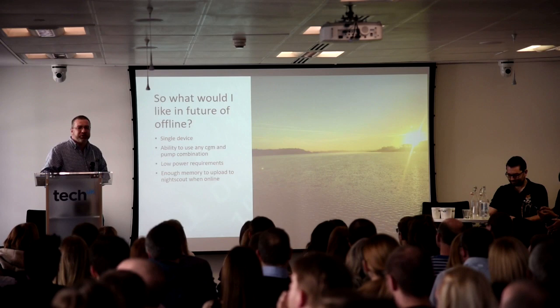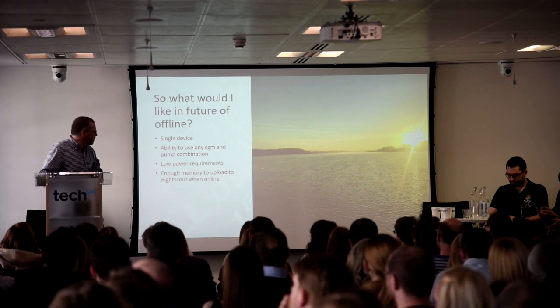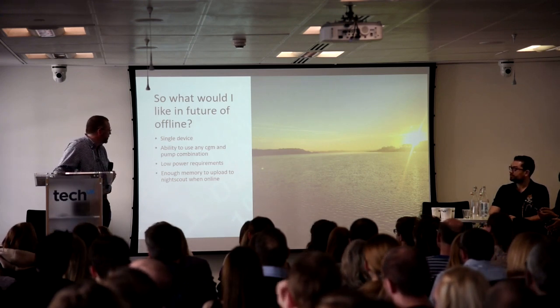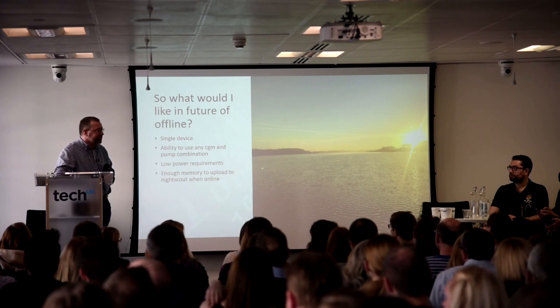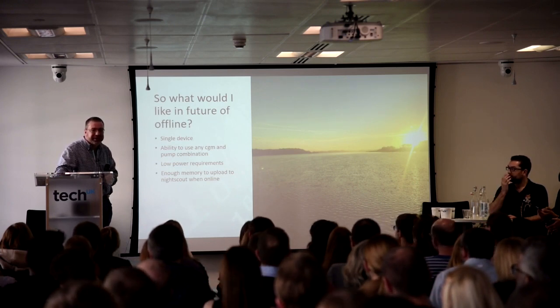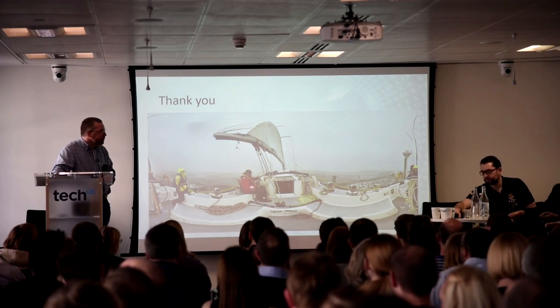What would I want in the future though? I just want a single device. I want the ability to use any CGM and any pump combination. And actually I want the ability to use different ones depending on what I'm doing. Talked about low power requirements. I do want it to have enough memory so when it does get to internet, I want to be able to update the Nightscout so I can have one consistent place to keep my data in. That was all I was going to say. So that was a really quick swoop through offline.